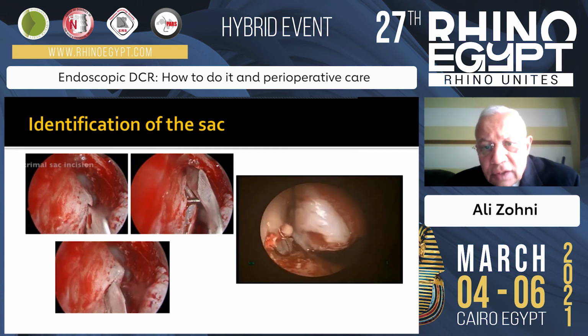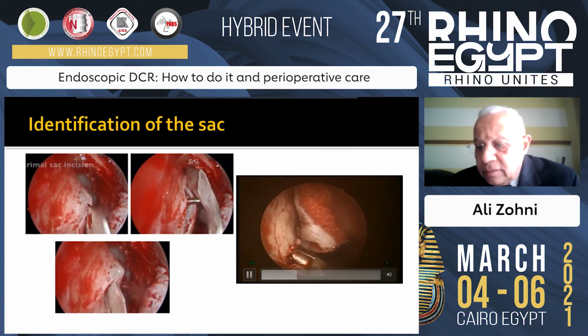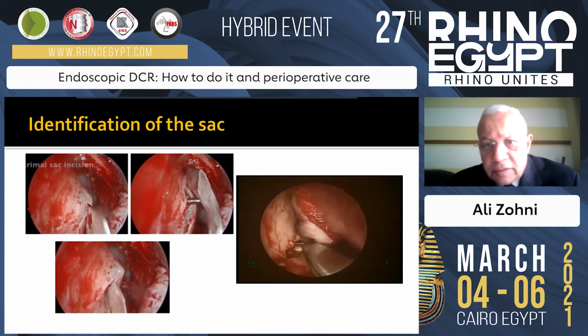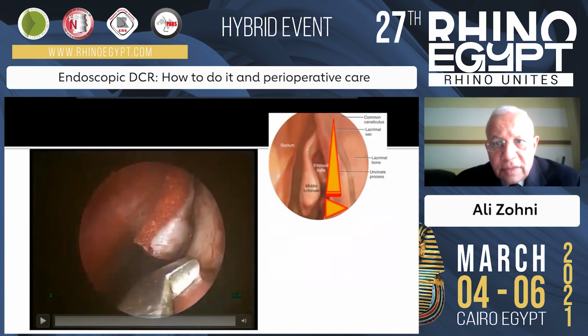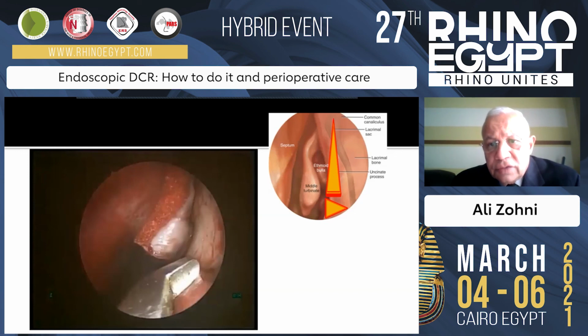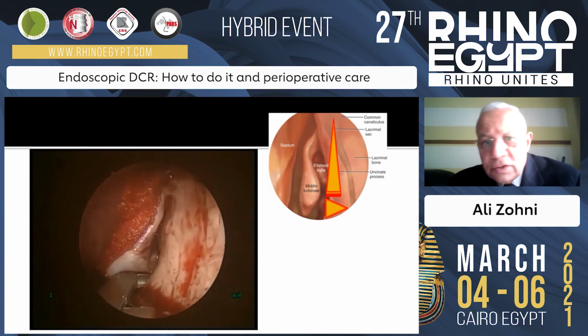This is the area of the nasolacrimal duct above the inferior turbinate, which is followed superiorly till we expose the lacrimal prominence, and we decompress the lacrimal system from three sides, as I mentioned. So in this technique, just to summarize the concept of it, we depend on the bone removal from inferiorly, which is followed superiorly to trace the lacrimal sac area. We don't do probing and we don't do stenting post-operatively. This is a very important starting point, and it has to be followed in this order.